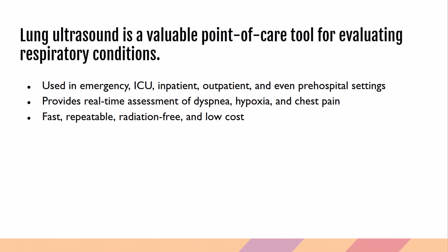Lung ultrasound is a valuable point of care tool for evaluating respiratory conditions. It is one of the most powerful tools a general sonographer can add to their skill set. It's fast, portable, and can be used nearly anywhere, again from the ER to the ICU to rural clinics, which is why it has picked up a lot of speed in the POCUS, or point of care ultrasound, exams that physicians are providing at the bedside.